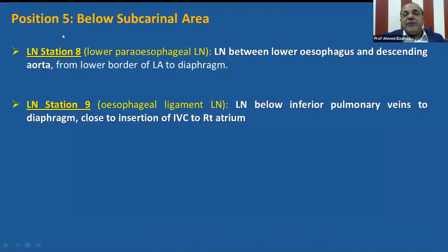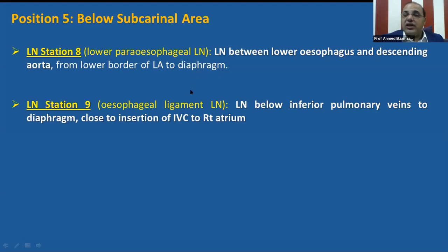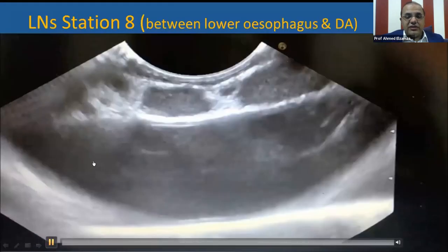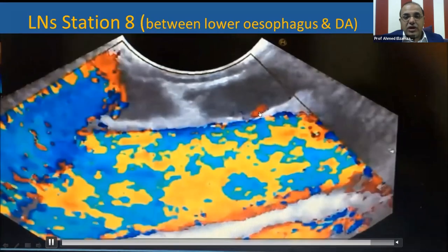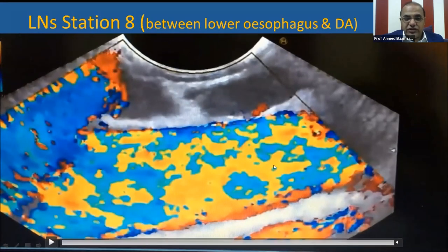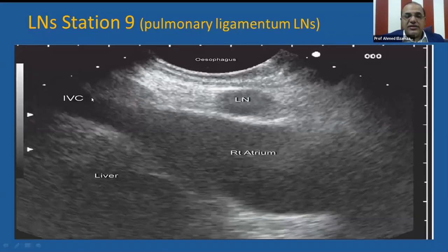Position 5, below the subcarinal area, also includes lymph node stations 8 and 9. Lymph node station 8 is the lower para-esophageal lymph node — the lymph node between the lower esophagus and the descending aorta. While lymph node station 9 is lymph node below the inferior pulmonary veins to the diaphragm, close to the insertion of IVC to the right atrium. This video shows lymph node station 8: the descending aorta and the lymph node between the esophagus and the descending aorta. This is lymph node station 9, with the upper portion of IVC close to its insertion to the right atrium and the liver — the pulmonary ligament lymph node, station 9.